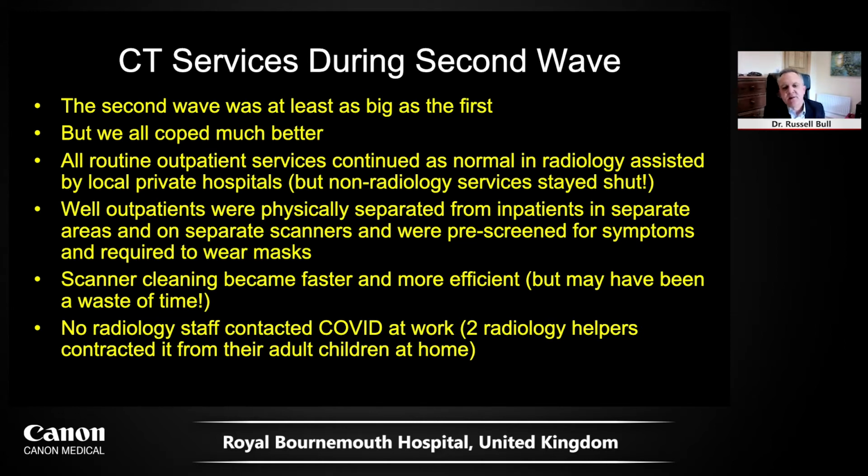All routine outpatient services continued as normal in radiology, assisted by local private hospitals. So we carried on, we did outpatient CT completely as normal, but non-radiology outpatient services all stayed shut. So radiology was the only thing that opened again, that everything else did shut. Basically well-fit outpatients were physically separated from inpatients and on separate scanners and were pre-screened for symptoms and required to wear masks. So we made sure they were low risk.